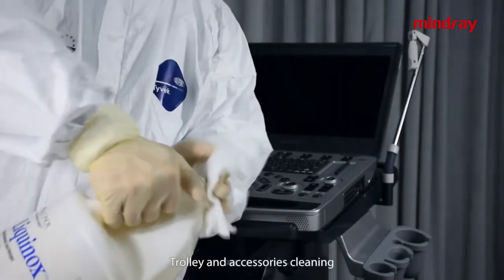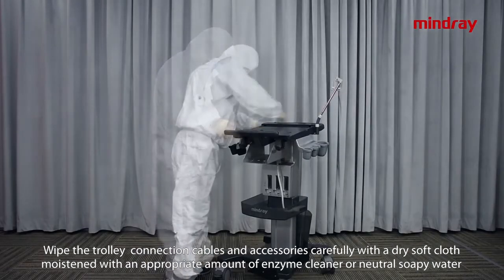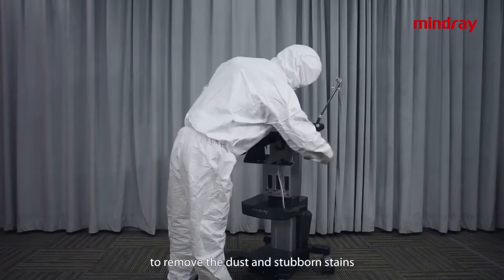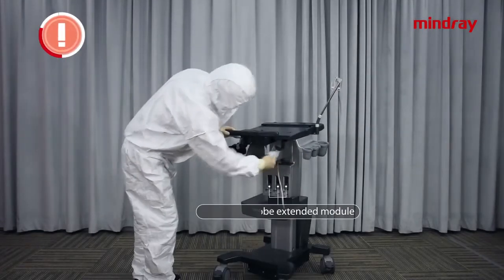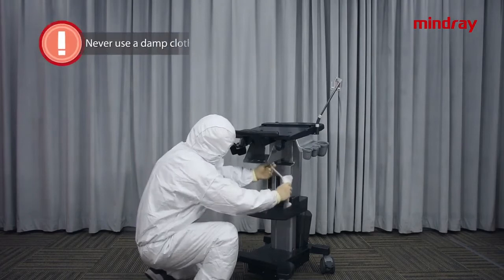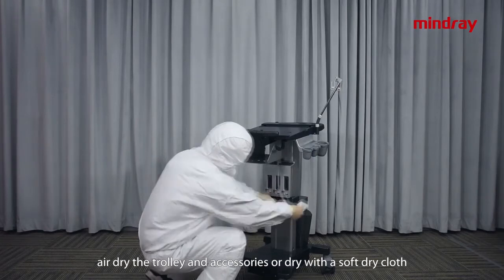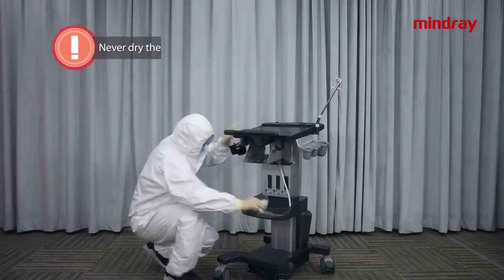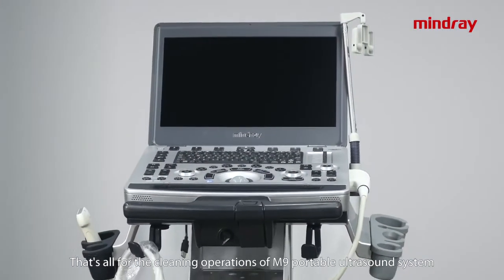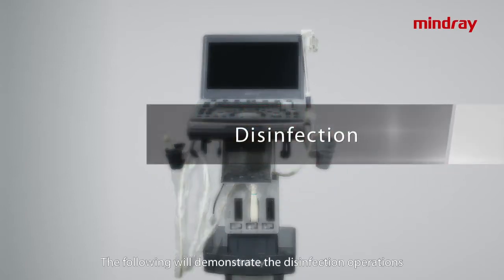Trolley and accessories cleaning. Wipe the trolley, connection cable, and accessory carefully with a soft dry cloth moistened with an appropriate amount of enzyme cleaner or neutral soapy water to remove the dust and the stubborn stains. Caution: never spill liquid into the probe extended module. Never use a damp cloth to clean the probe sockets. After wiping, air dry the trolley and accessories or dry with a soft dry cloth. Never dry the trolley and accessories by heating. That's all for cleaning operations of M9 portable ultrasound system. The following will demonstrate the disinfection operations.